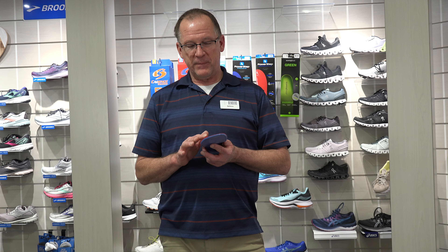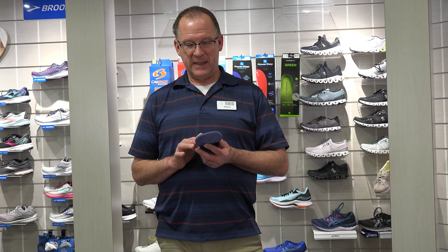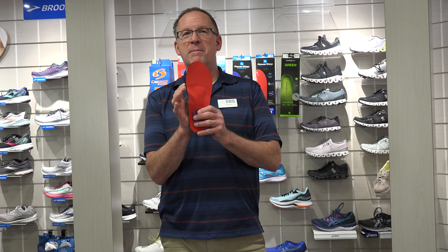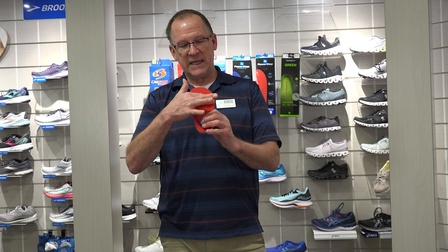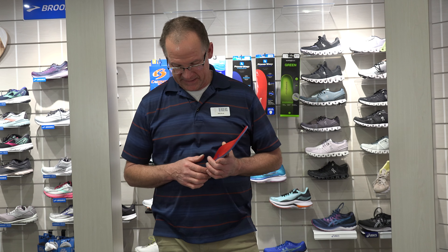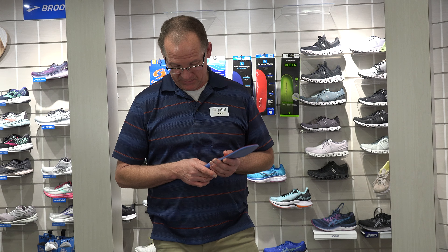People who are on their feet all day, particularly on cement all day — school teachers, nurses, administrators — at the end of the day this transverse arch lifts them up, lifts up that arch right behind their metatarsal head, and it actually offloads the skin. And then you've got this quarter inch of silicon rubber. Around hour five or six, these start to feel really nice. I'll share that with customers as well.